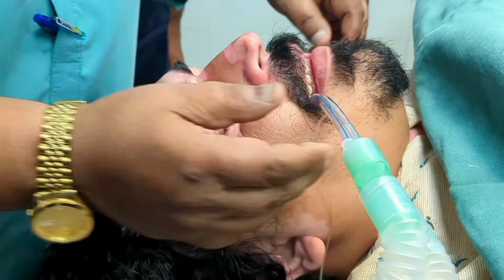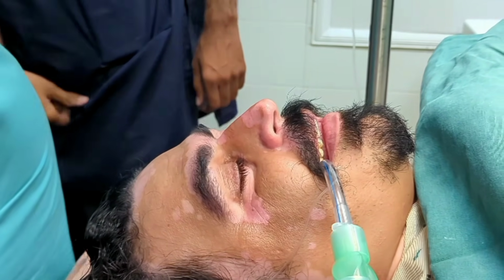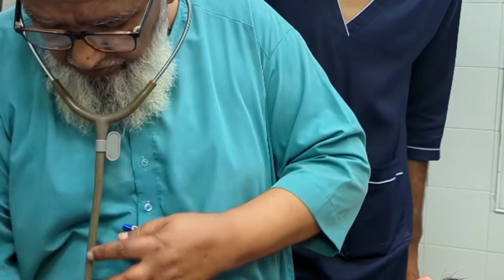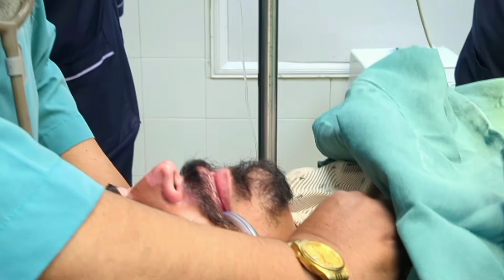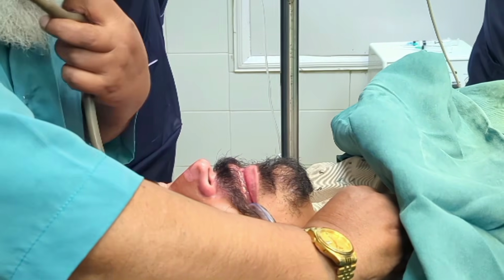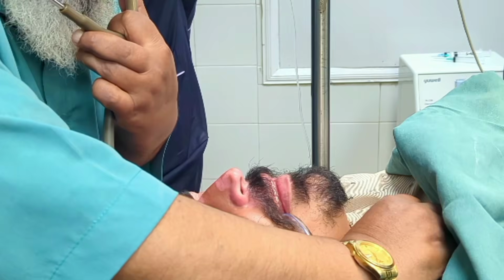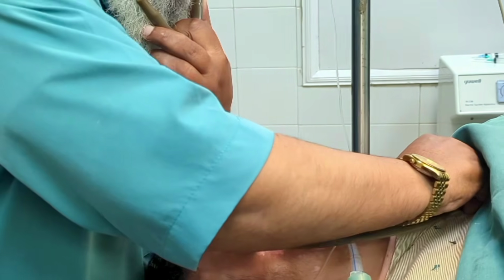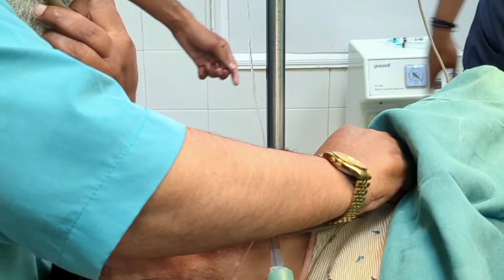However, before fixing the tube permanently, it is critical to confirm its correct placement. Misplacement of the tube into the esophagus instead of the trachea can have dangerous consequences. Therefore, verification is always done in multiple ways. The first and most immediate method of confirmation is by observing chest movement and monitoring the capnography, if available. But in this case, we primarily relied on auscultation with a stethoscope.